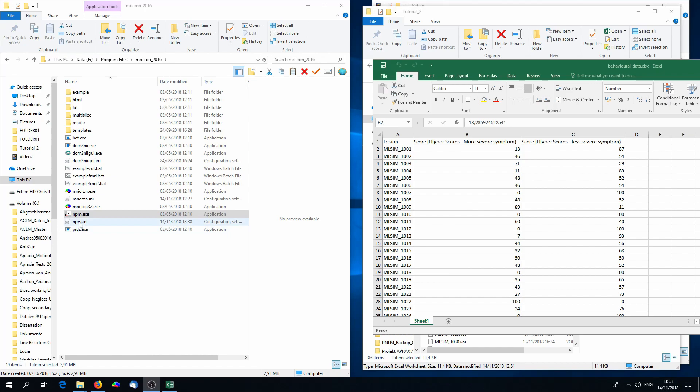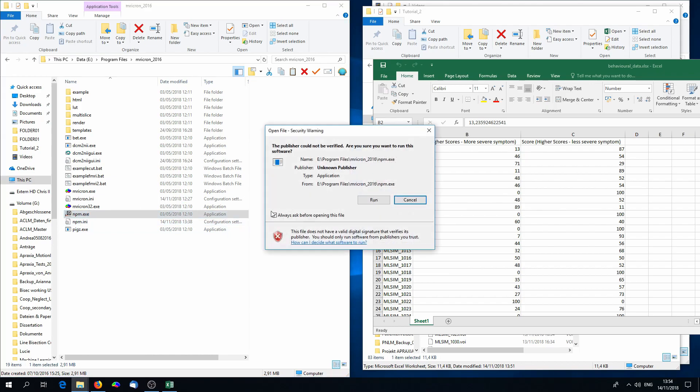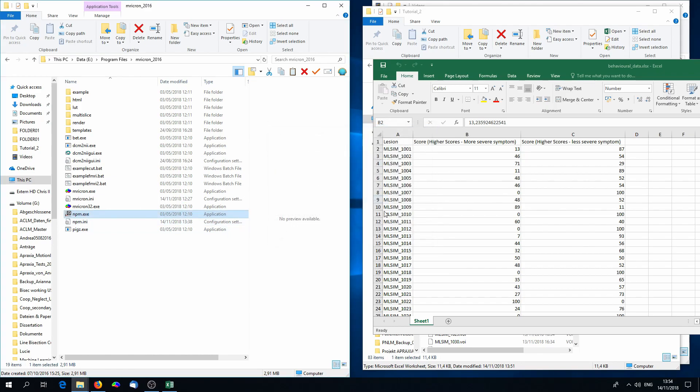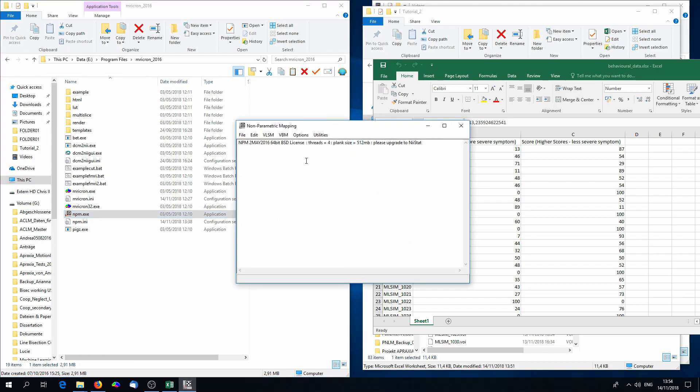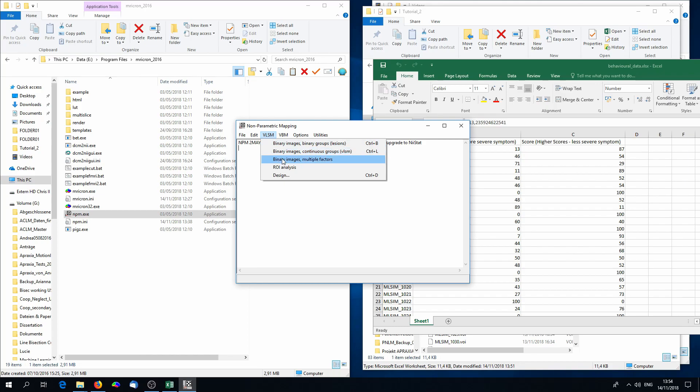Now we can start the lesion analysis with NPM. Double-click on NPM exe, and in the upper panel of NPM you'll find VLSM. That's where you'll find several kinds of analysis for binary images. That is something we already have available. And for either binary groups, that means binomial behavioral data, which is not the case for the example data set, or for continuous groups. This is for continuous behavioral data, and this is what we have available. We have scores ranging from 0 to 100.